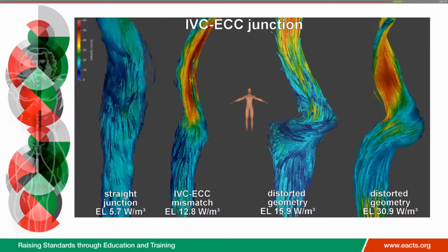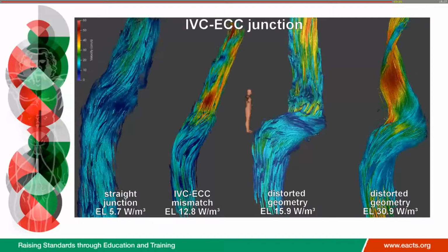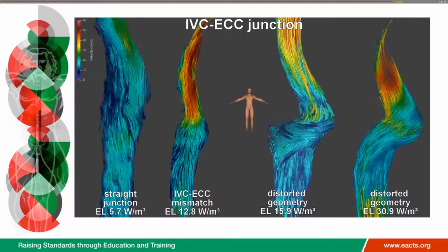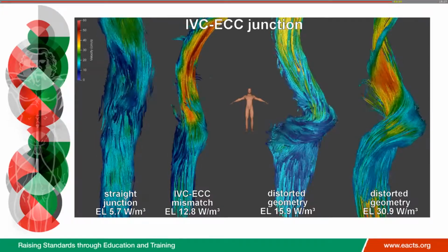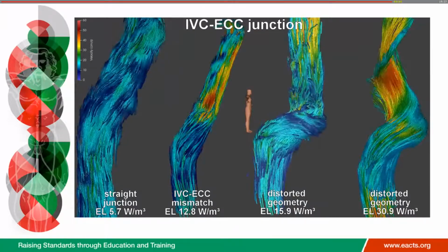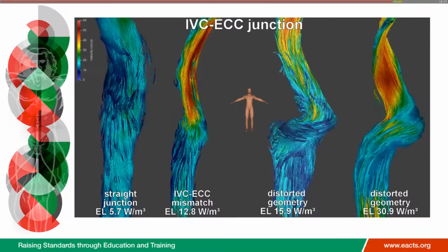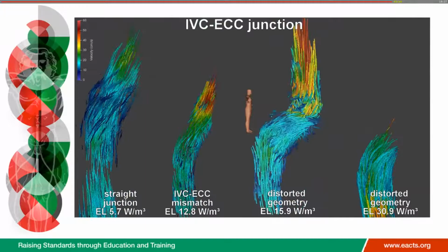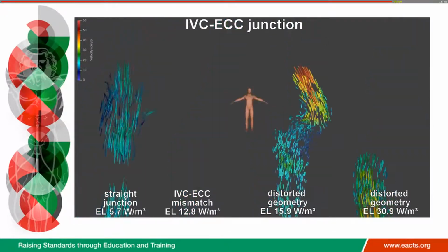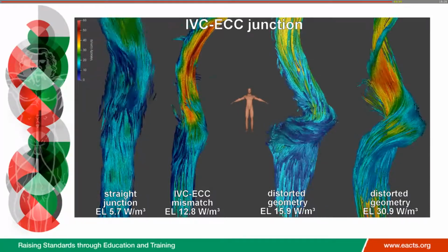Thanks, David. I actually agree with what Tom said about the mismatch of the IVC size and the conduit. The other thing that I find is that sometimes the IVC is surprisingly more anterior than what I expect, and in other patients it's more posterior. So I don't know if there is any way you can correlate the acute angle in those patients in which the IVC is more posterior, and you have to run the conduit slightly longer to avoid impinging on the pulmonary veins. So I don't know if there is any way you can look at your preoperative cross-imaging data.